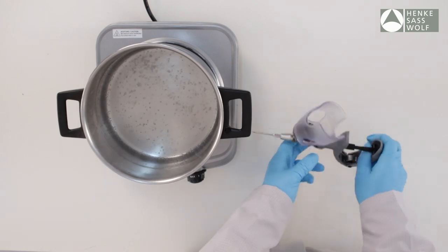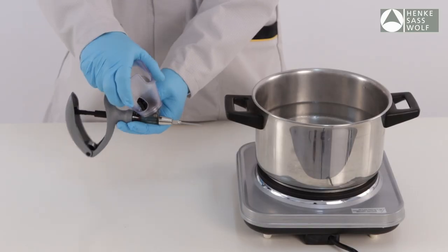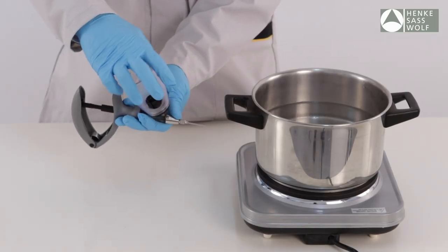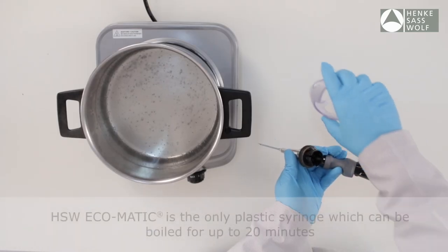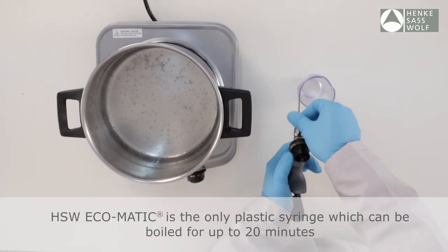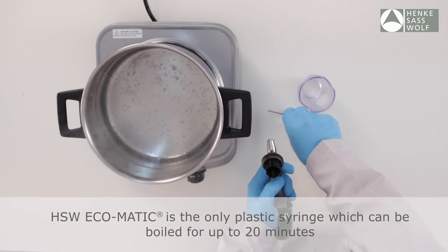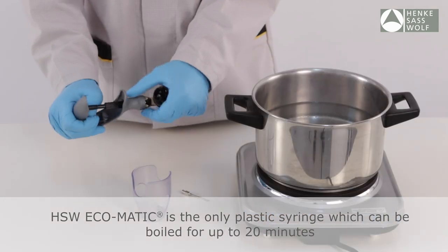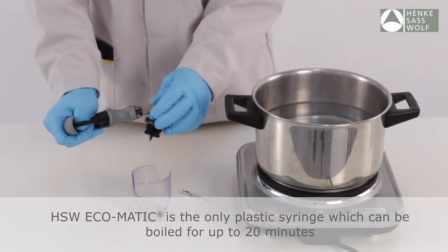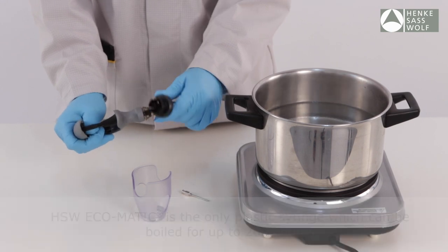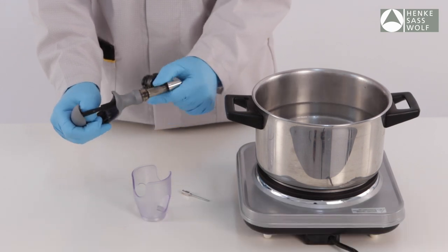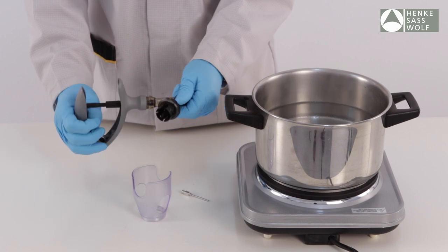It is recommended that the Ecomatic and a supply of needles or nozzles be disinfected before and after each use. Suspend the complete Ecomatic including needles or nozzles in a container of water and boil for up to 20 minutes. Ideally the cylinder will be disassembled from the handle and the syringe will be boiled in a disassembled condition.